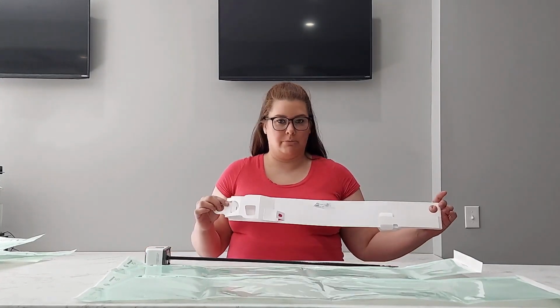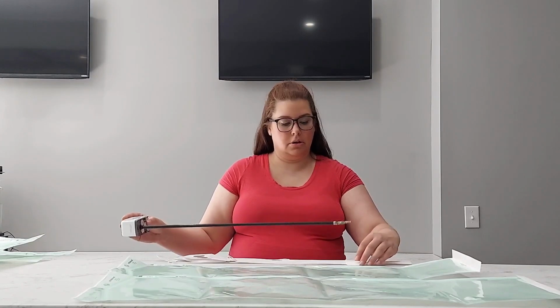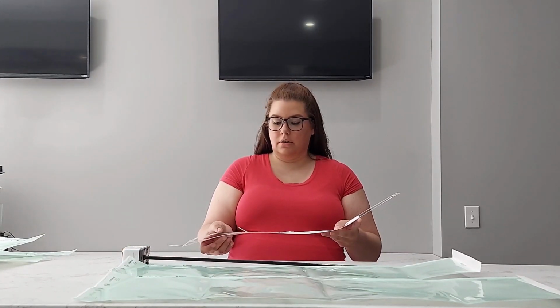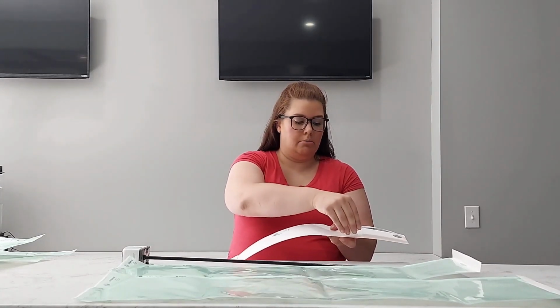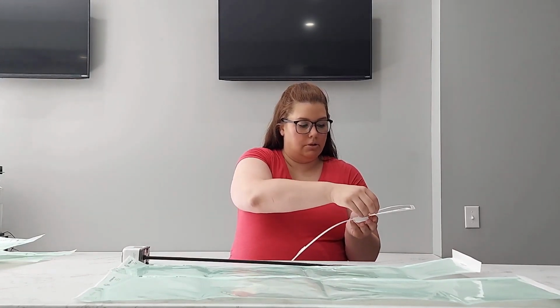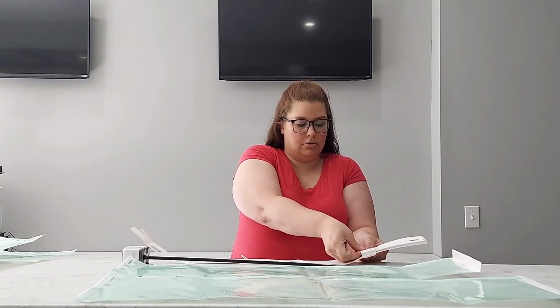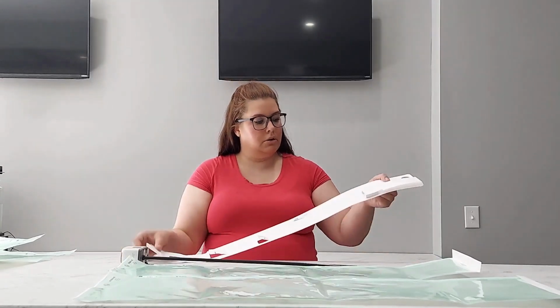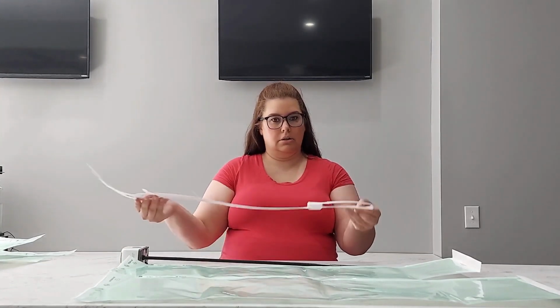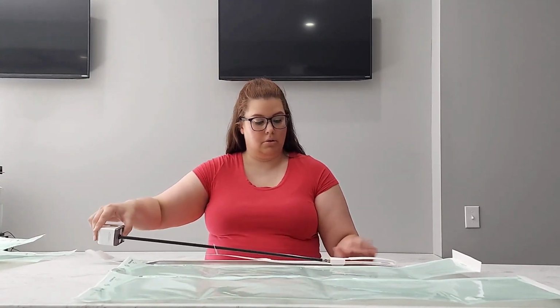We are going to be talking about robotic instrument protectors and robotic peel pack holders. So the robotic instrument protectors will fit the robotic instrument arms, and these are already creased. So all you have to do is put them in their little holes so that the instrument stays protected, especially with the tips. It'll save us from having to put the tip protectors on the instrument. So once you do these two, this will stay lifted. You'll put the instrument in this hole, put your tip in the holder, and then we are ready to create the end piece.